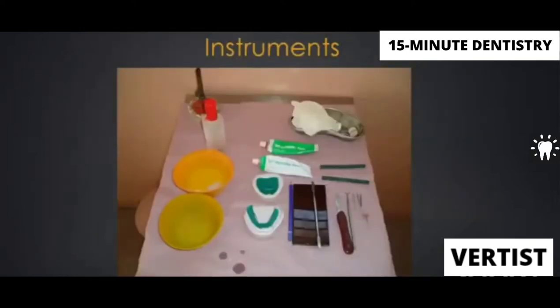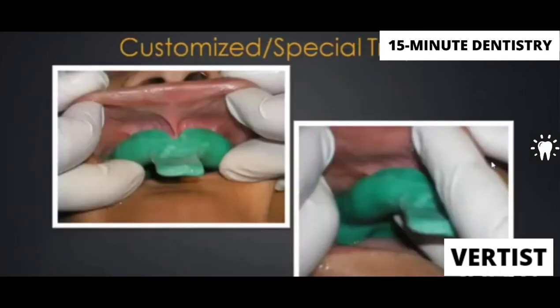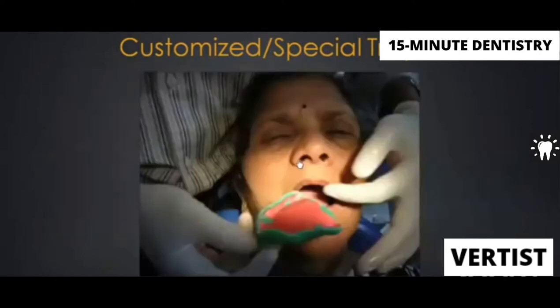Instruments, I will not go into detail regarding the instruments. We all know what instruments are supposed to be used. Now, the first thing is you check the custom trays in the patient's mouth. Hopefully, all of you would have done this before the examination. Ensure that there is proper 2 millimeters of space all around, including in the frenum region. Okay, I'm again emphasizing, including in the frenum region. Hopefully these videos play.